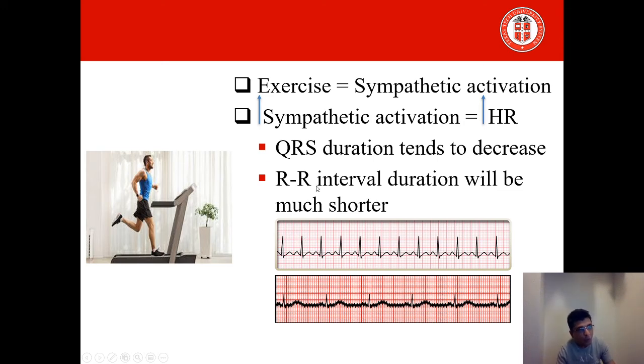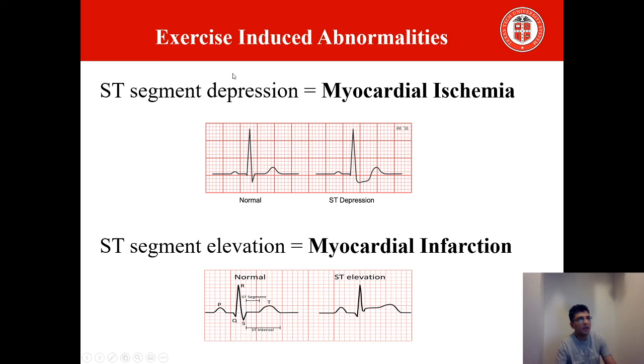And I want you to know what an RR interval duration is, because you have to measure and calculate it for your data sheet assignment. Now, we are done with the ECG changes in exercise. Now we'll concentrate on the exercise-induced abnormalities.